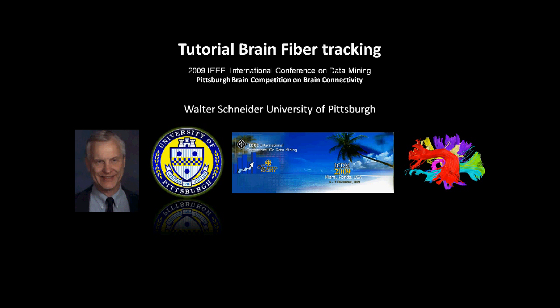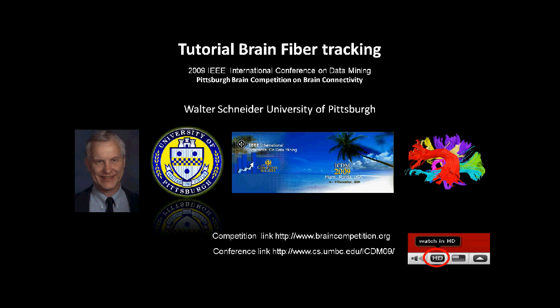And what we'll do is talk about how to segment the brain into fiber tracks. For information, go to the web links below. If you want to see this in high definition, you might click the HD button.